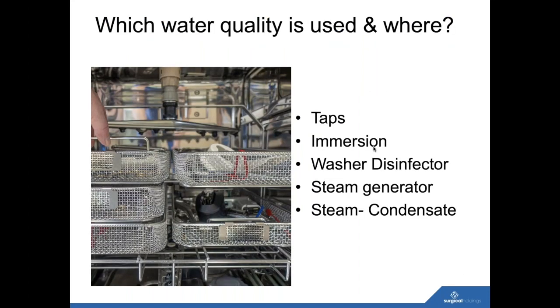And Daniel, I've actually had instances where I open a sterile set to evaluate it, I've picked up a hollow-handled curette or a mallet, and I've actually had water drip out of it onto me. So it's going to the operating theater with this basically contaminated water in the handle of the instrument. Great point. I had a similar experience in a hospital where we were talking to somebody in their sterile department, and they were giving us a bit of a hard time about certain things and how they should be validated. I went to inspect a set, and the first instrument I picked up was a hollow-handled retractor or something, and it sprayed in my face. That was quite a shocking moment, really. But certainly something to look out for.